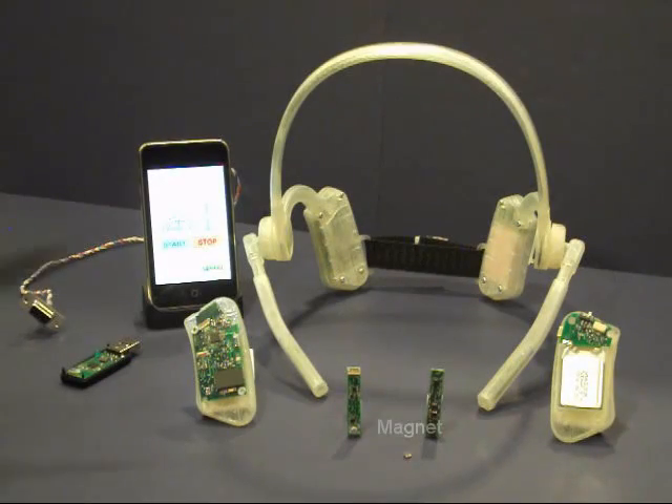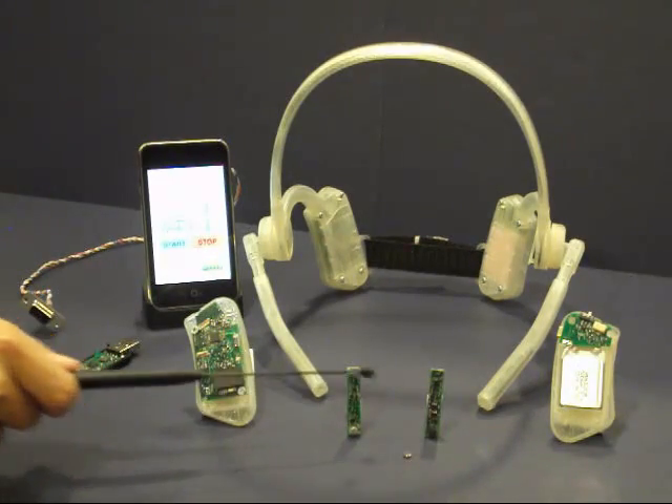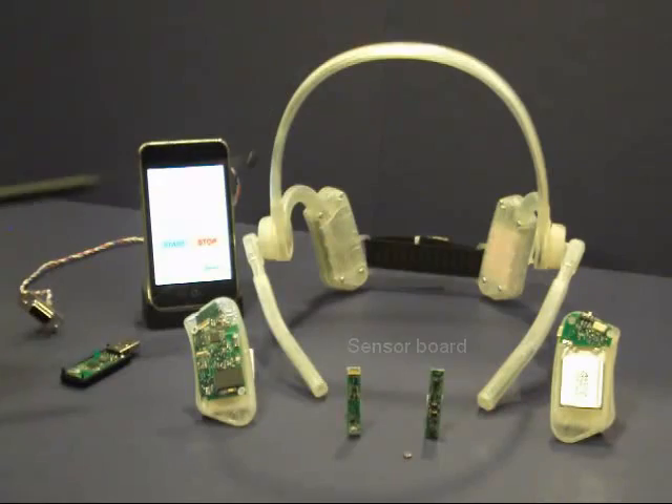In the tongue drive system, a small permanent magnet is attached to the user's tongue by glue or tongue piercing. An array of magnetic sensors are mounted on a custom designed headset and used to detect the change of magnetic field as a result of the tongue movements.